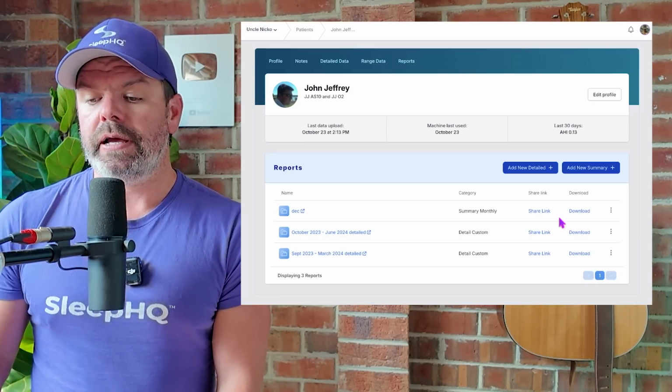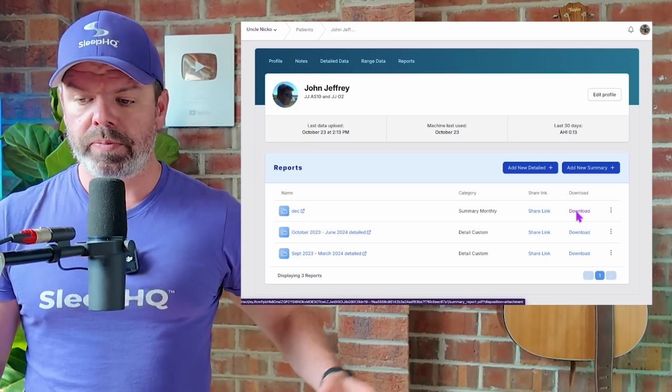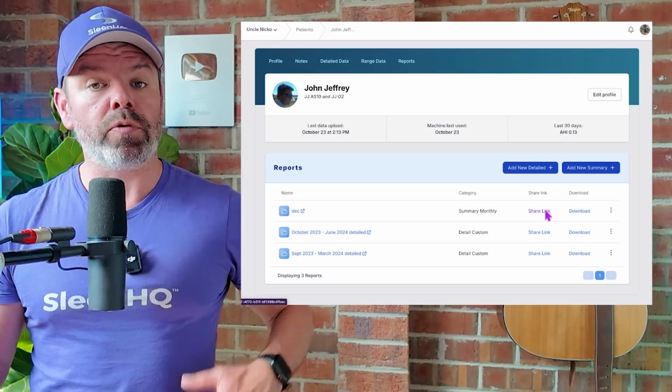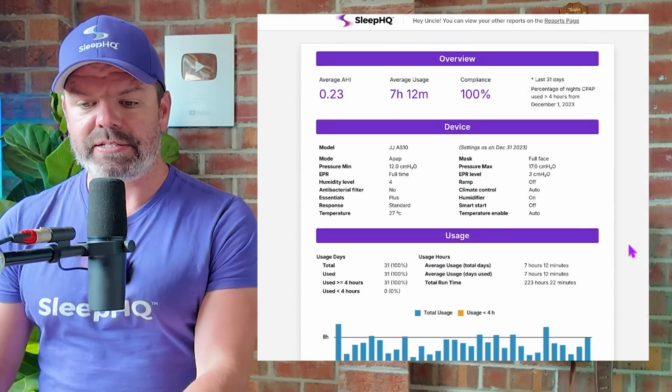There we go. And now I can download a PDF if I want, if I'm going for a specialist appointment. Or I can just click share link, and this will open up the report in a new link. All right, here it is.